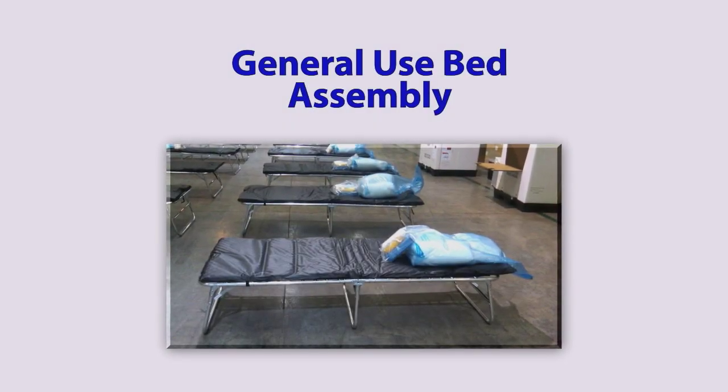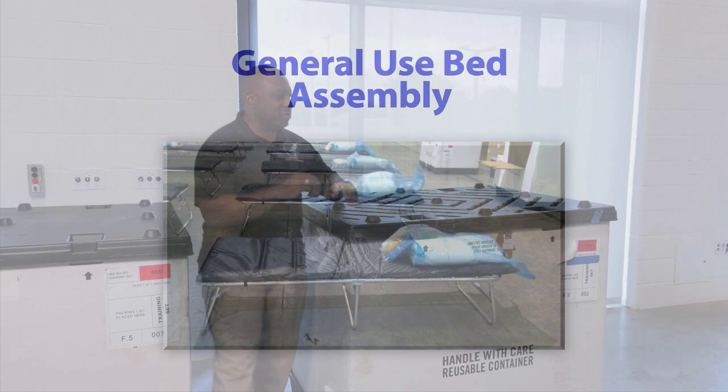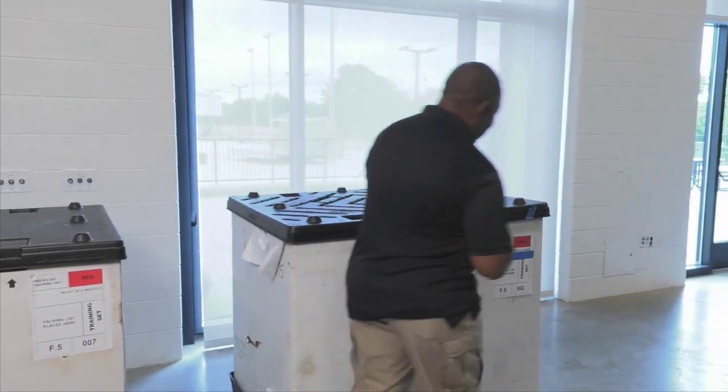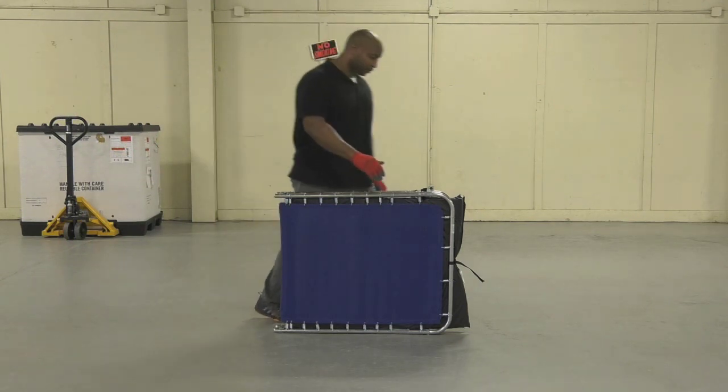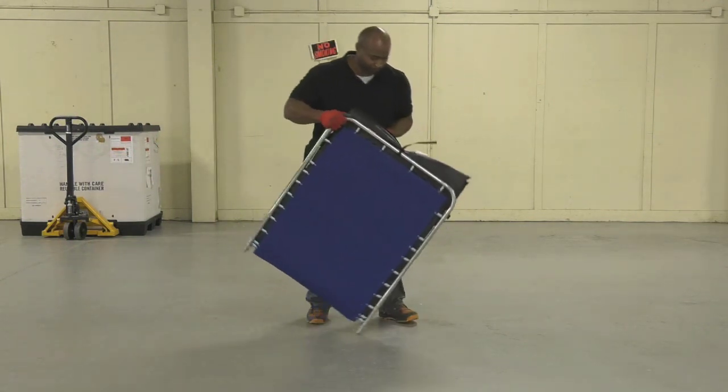The GUB, or General Use beds, are delivered in tri-walls with a red label marked General Use. These beds are not very difficult to assemble and can be put together by one person.